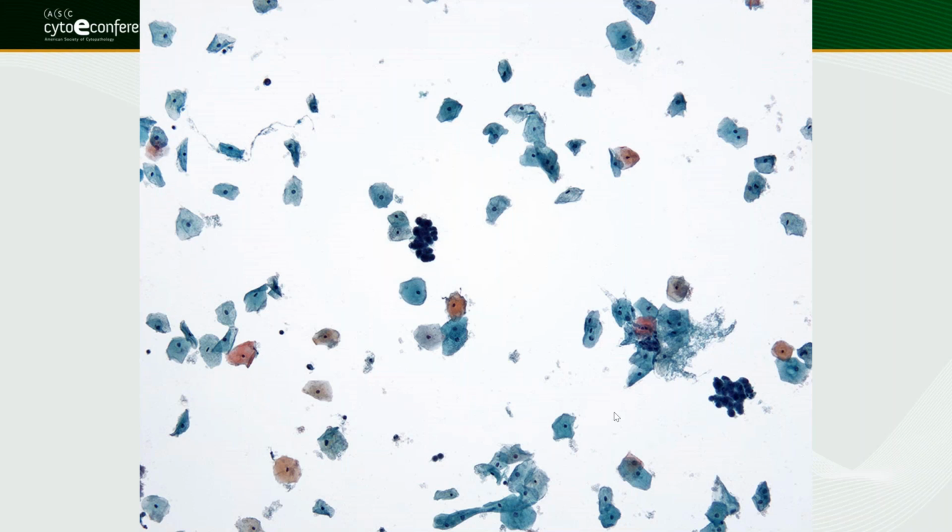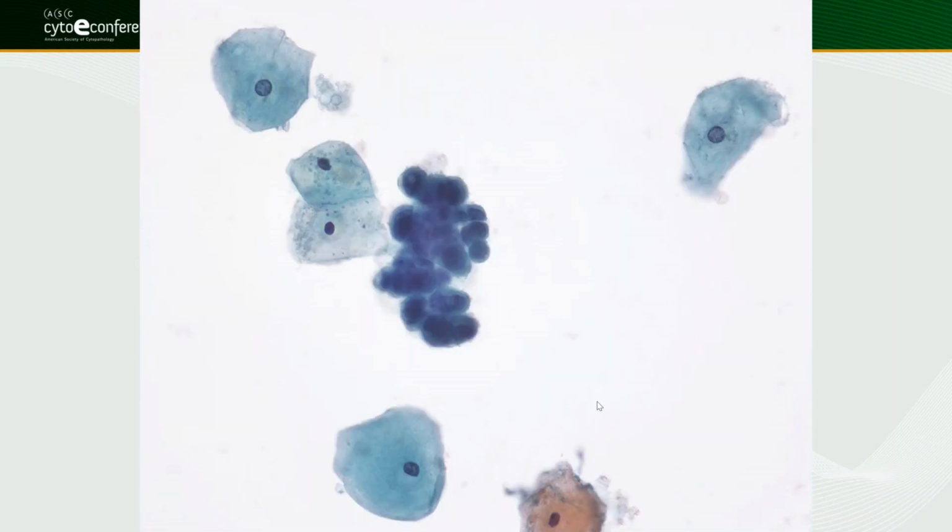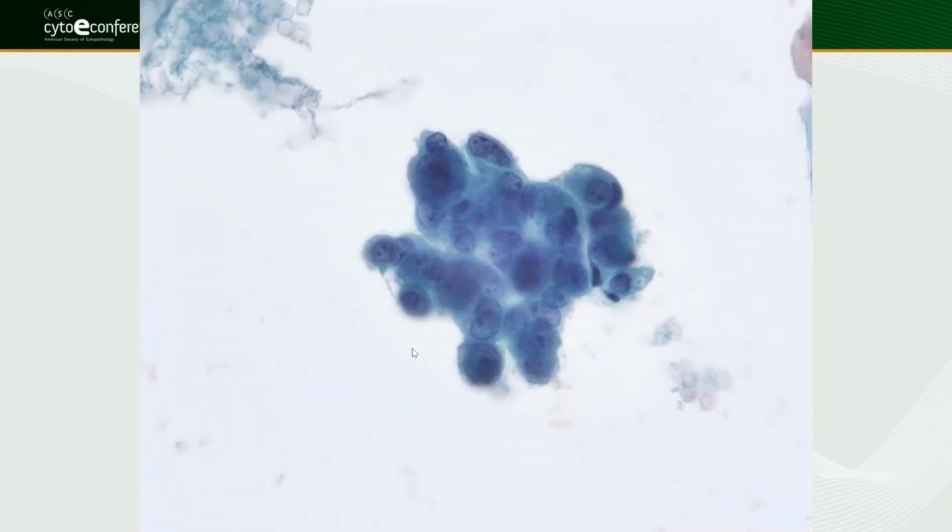And so we saw these two groups, so let's go on high power, and they actually don't quite look like the endometrial cells I showed earlier, or the atypical endometrial cells or even endometrial adeno. They don't quite look like that. And let me see. Yeah, this is a better one.